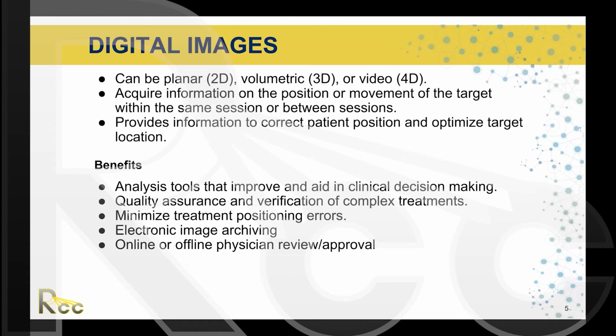Another benefit of digital imaging is the ability of physicians to remotely review and approve or request changes to the patient position. This can be done in a lot of cases with the patient still on the table, or after the fact, when the physician can review them offline.